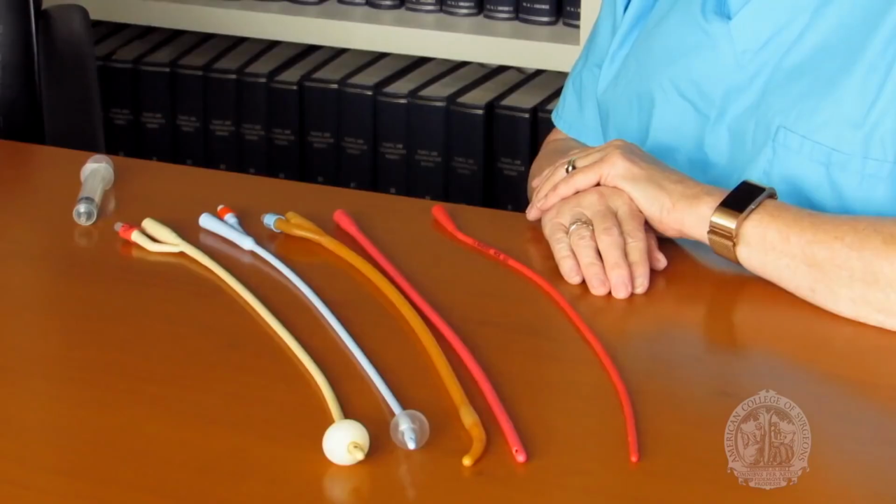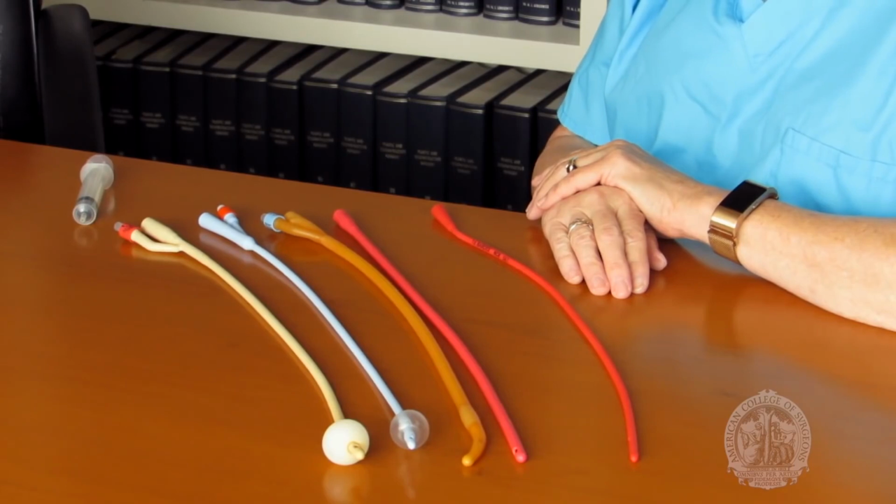When you determine that your patient needs a bladder catheter, talk to the patient explaining why they need it, what will happen during the placement, and talk about risks, alternatives, and answer any questions that they may have. Inquire about allergies to latex or iodine, as many kits come with parts that contain these chemicals. Ask the patient if they have ever had a previous catheter inserted, and if there was any difficulty with the insertion. Let's briefly talk about the supplies you'll need for placement.